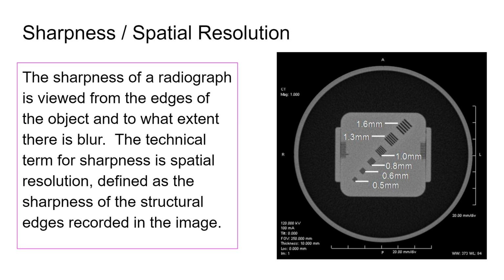Sometimes you'll see a question on a test, like how small of an object can be resolved if you have a system that has certain things that we didn't learn yet. Obviously the smaller that you can resolve an object, the better it is for the patient, because if you can't resolve an object and can't identify it, you have a misdiagnosis or no diagnosis, who knows?